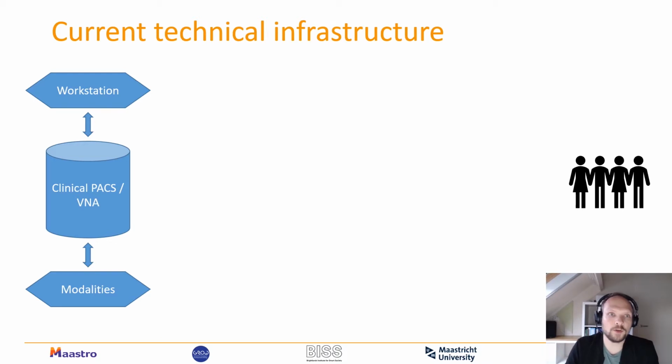So how the current infrastructure works on a technical level is that on the clinical side, we have a clinical workstation, the clinical PACS system or the vendor neutral archive, the VNA, and of course the modalities.